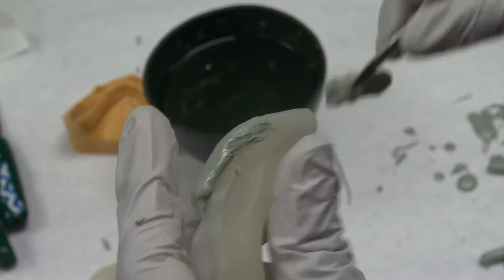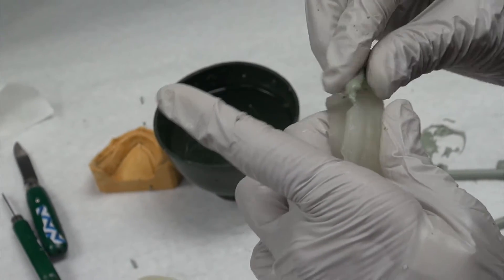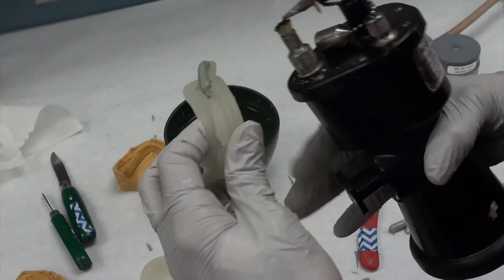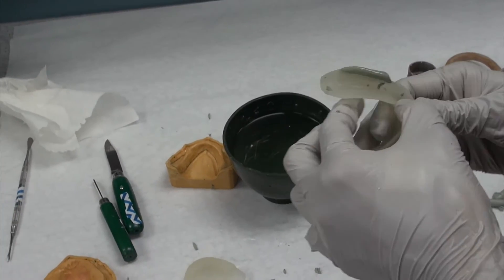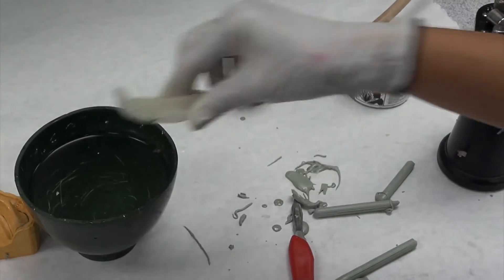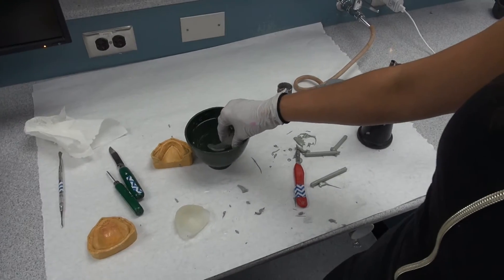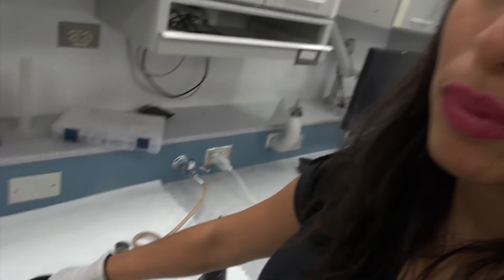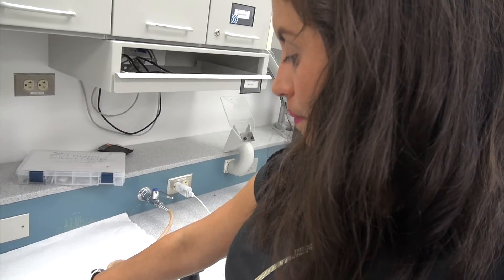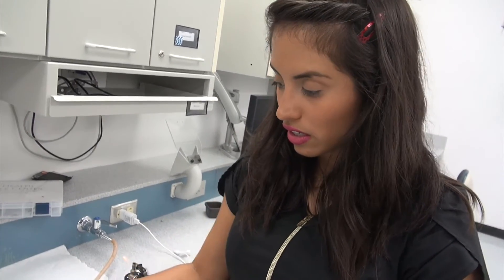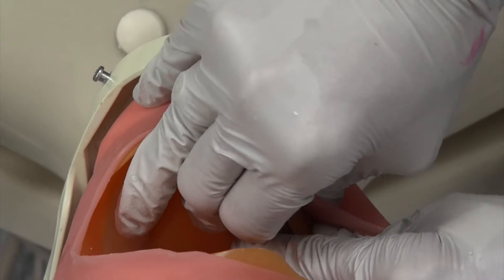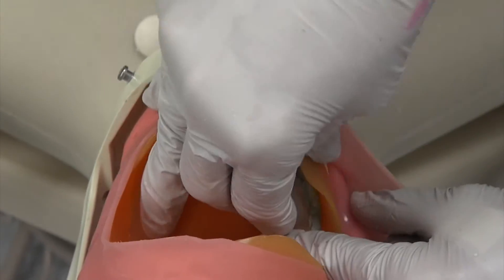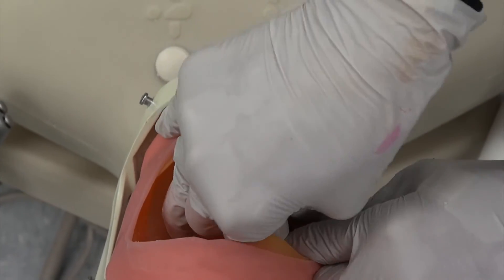I have no idea why it's not sticking, maybe because we just made them right now. So, these custom impression trays were just made a few minutes ago for the purposes of this demo. So, it's possible that the MRA is still stuck on here, so you want to make sure to wash them really, really good. Okay, so soap and water really well. And then you want to make sure that your trays are pretty dry. And that's dry when you apply it like that first coat.